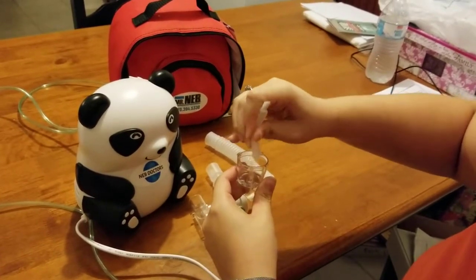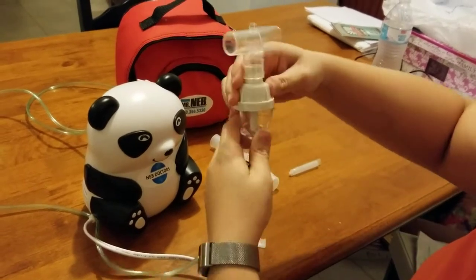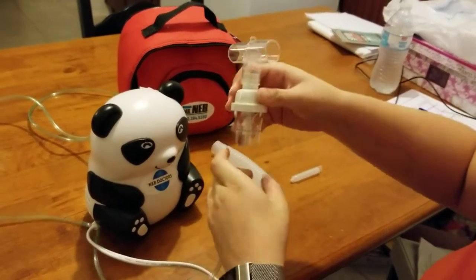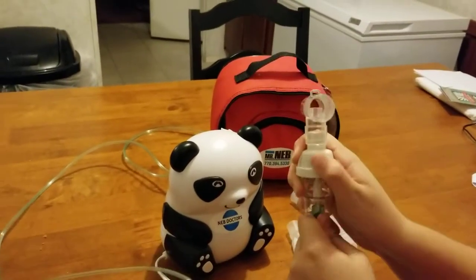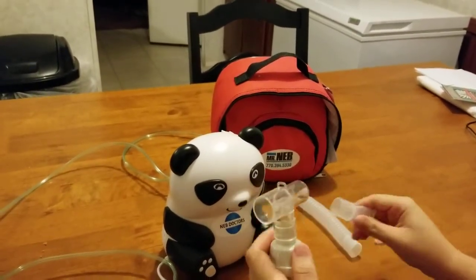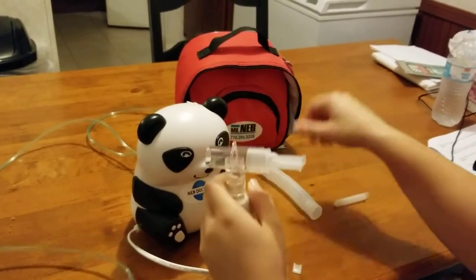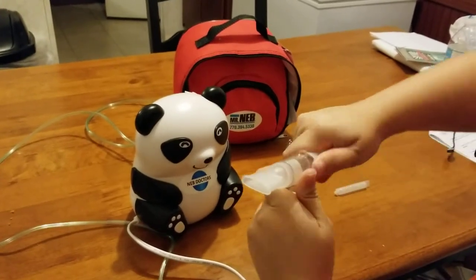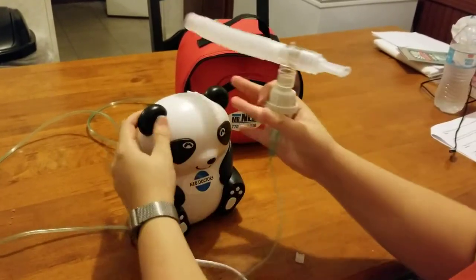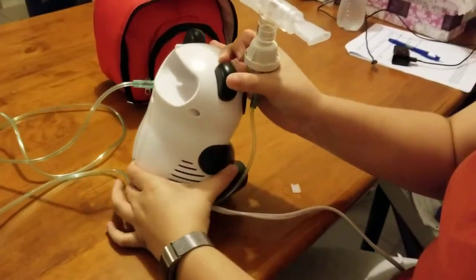Put this on, and then you hook the tube up to it. This mouthpiece goes on one end and the tube goes on the other, and then you power it on right here.